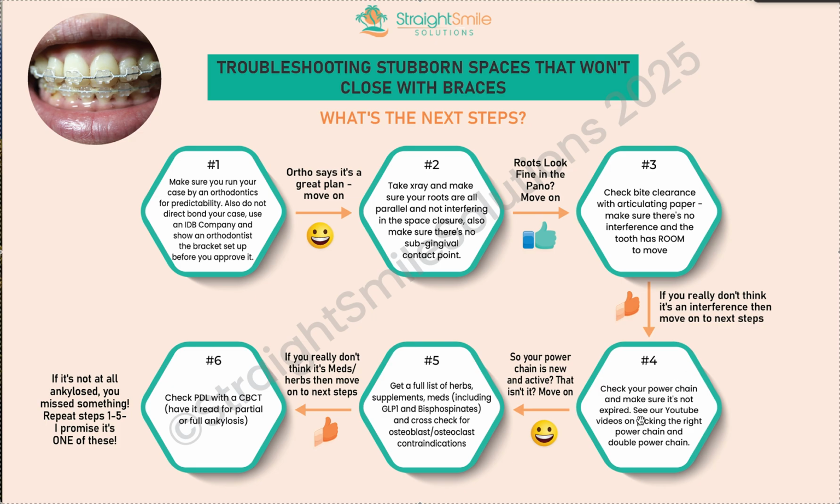So anyways, there is something called double power chain. Double power chain is a special technique. I did make a video on it. It is tricky. There's a few other videos on YouTube. If you put in double power chain, you might see someone actually putting it on, but it's basically a way of weaving two sets of power chains. It does work. It's tight, and I wouldn't do it more than 3 weeks at a time and have them check, because it just builds plaque like crazy. But the sucker does work as long as you checked all the other stuff. But sometimes just getting a new fresh power chain makes a difference, just ordering new ones.